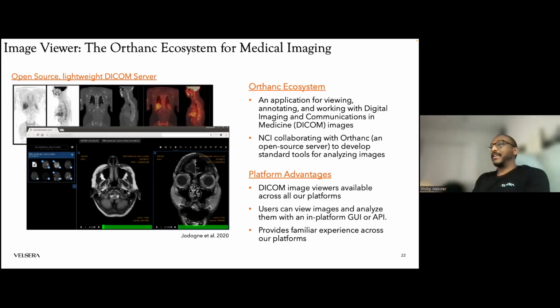And then one of the other really great tools that we have is the image viewer. What the image viewer does is it uses DICOM images, digital imaging and communication. That's like X-rays, MRIs, those types of things that you would get done at a hospital or from a doctor when something is suspected, or if you need a diagnosis. The image viewer allows you to interactively explore these images and see what the predictions are.